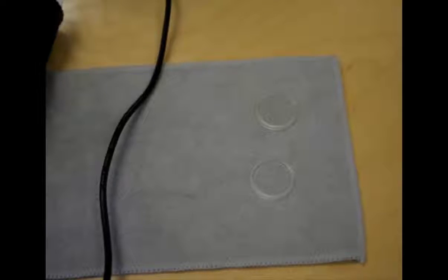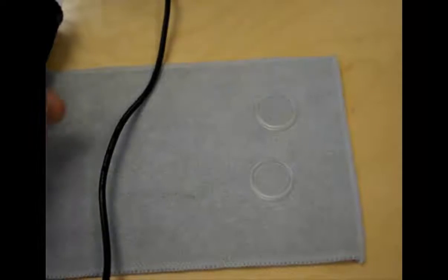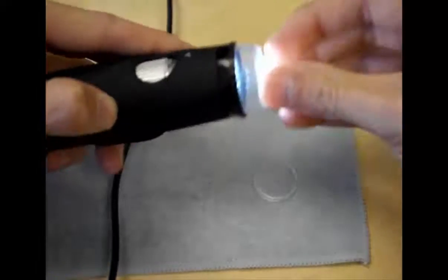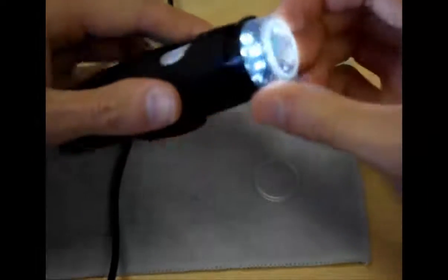These are the glass covers. You can put these right onto the front of the scope spacer just by pressing it into place, and these can be used with oil for immersion media.